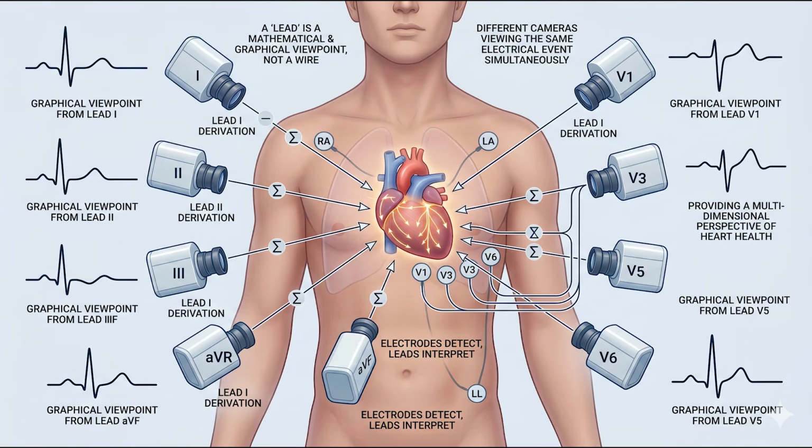You can think of leads as different cameras positioned around a stadium. While every lead is analyzing the exact same electrical event in the cardiac cycle simultaneously, they are each viewing it from a unique angle, providing a multidimensional perspective of the heart's health.